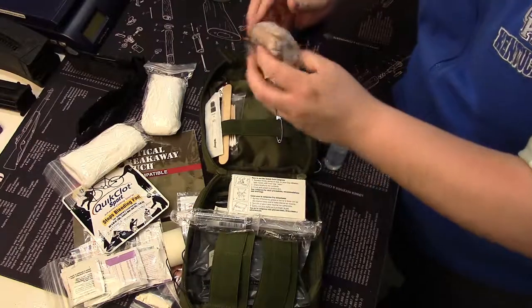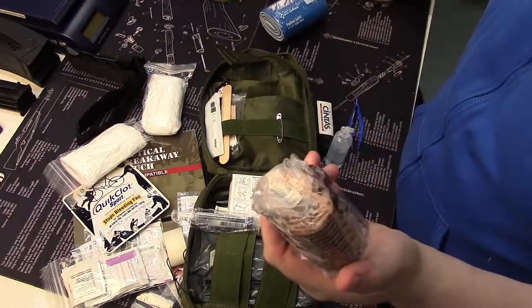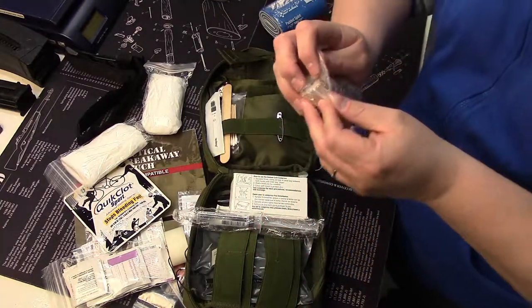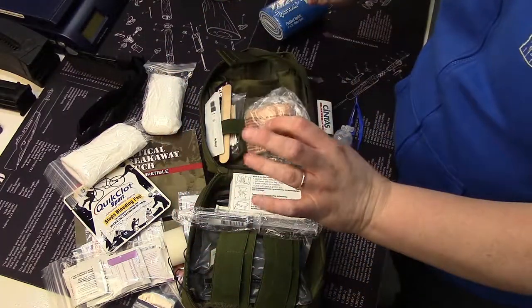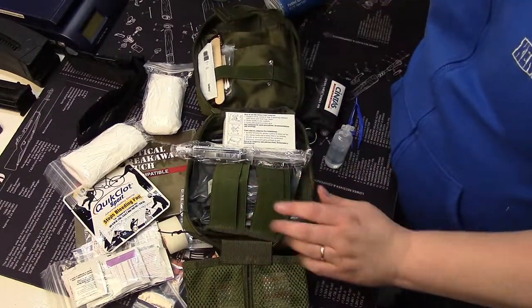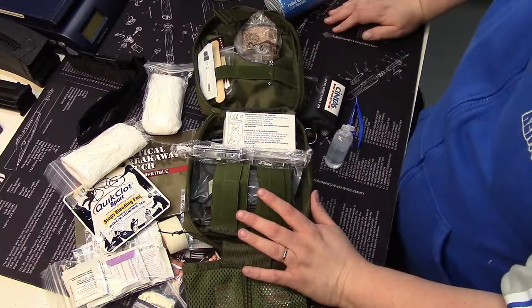Lastly, I keep a roll of self-adhering bandage that goes by several names — this happens to be Coban, the 3M product. These are fantastic, I absolutely love them. This kit is well worth the money. There are more expensive bags out there, but this one is going to be well under $20, and I highly recommend it.